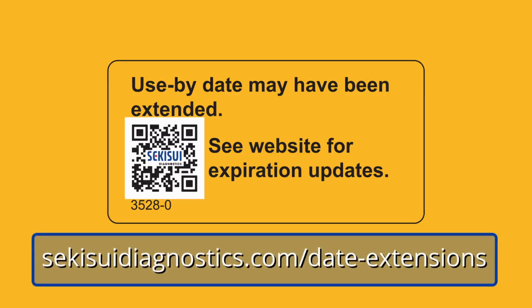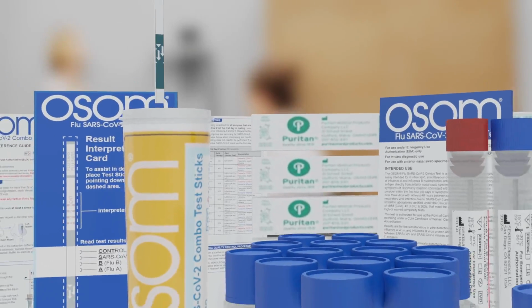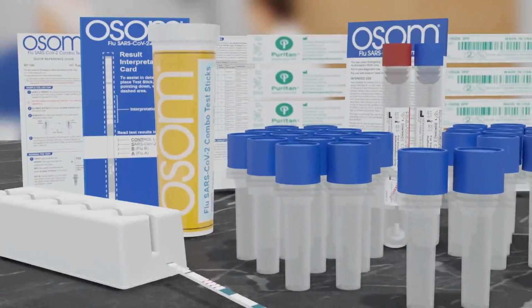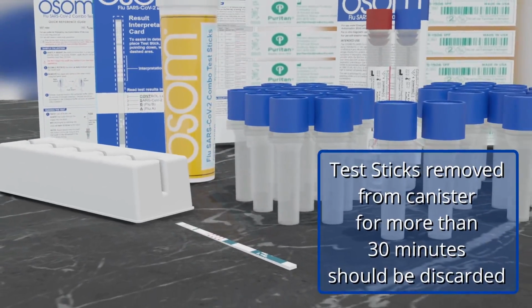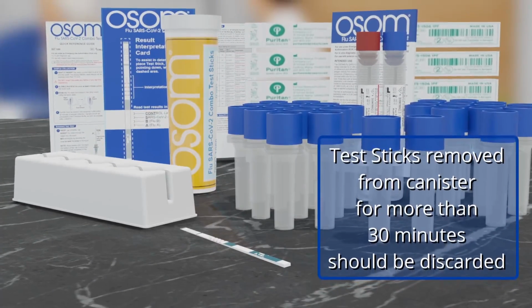Please go to sekisuidiagnostics.com/date-extensions or scan the QR code located on the kit stuffer or expiration sticker located on the front of the box to see if the dating on your kit has been extended. Recap the desiccated test stick canister immediately after removing a test stick. Test sticks that have been outside of the desiccated container for more than 30 minutes should be discarded.